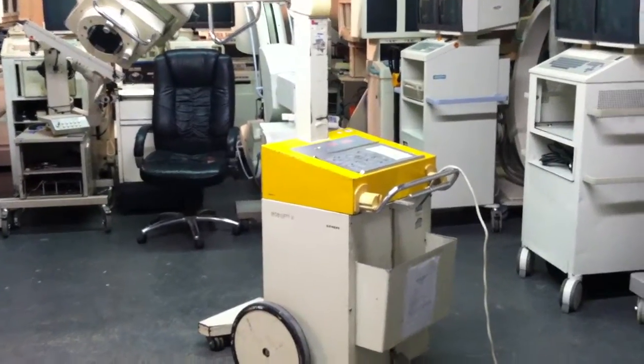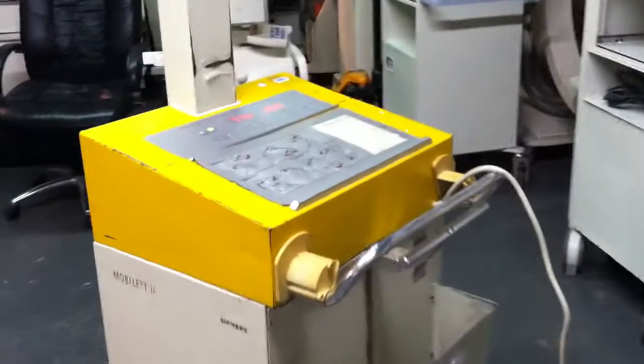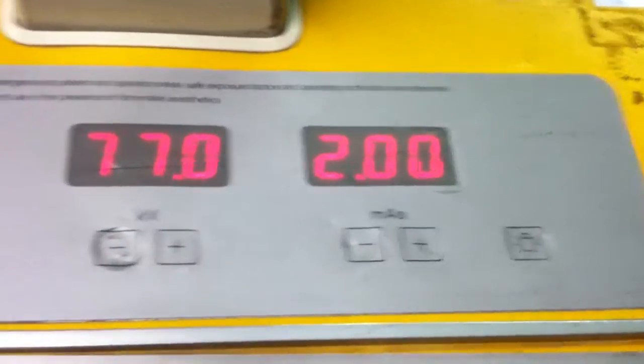This is a demonstration of the Siemens Mobile-A2. We're turning it on, making sure everything is working properly. We've already turned it on earlier. Everything is working fine.